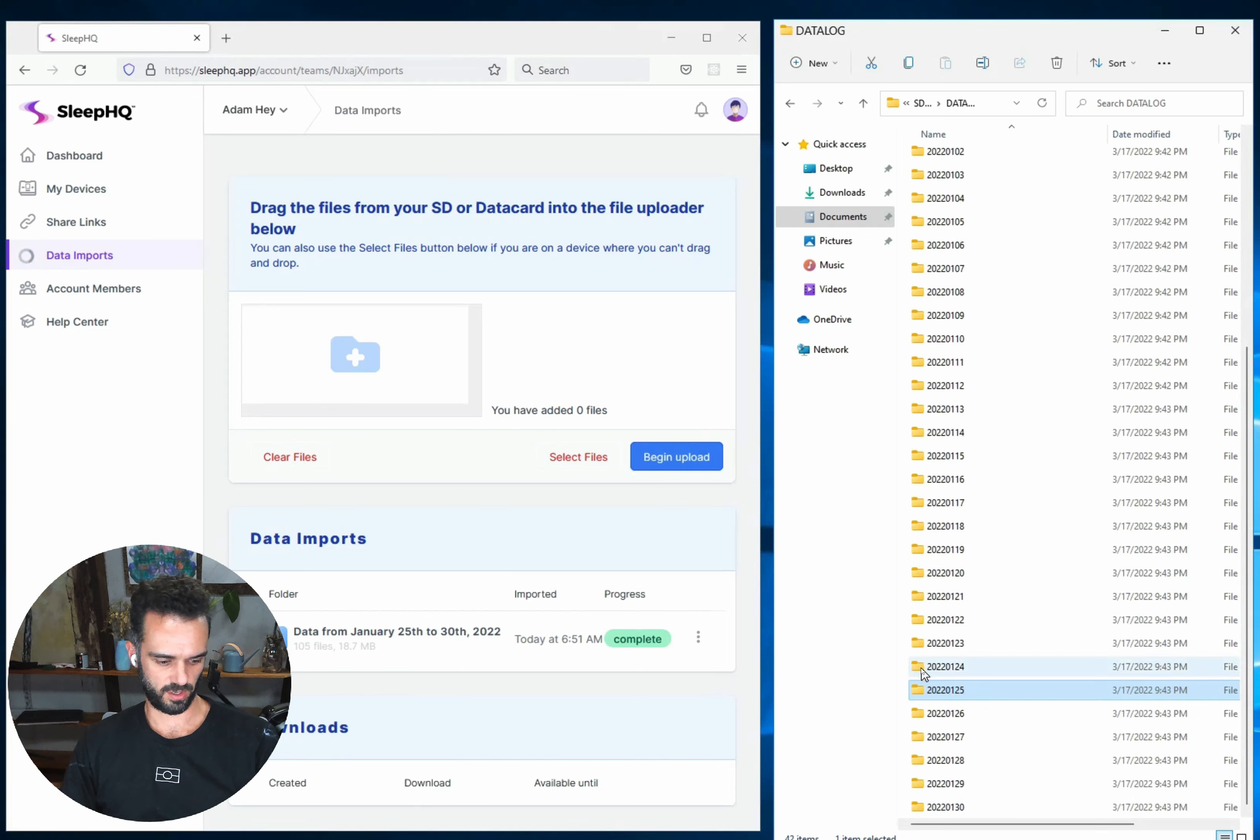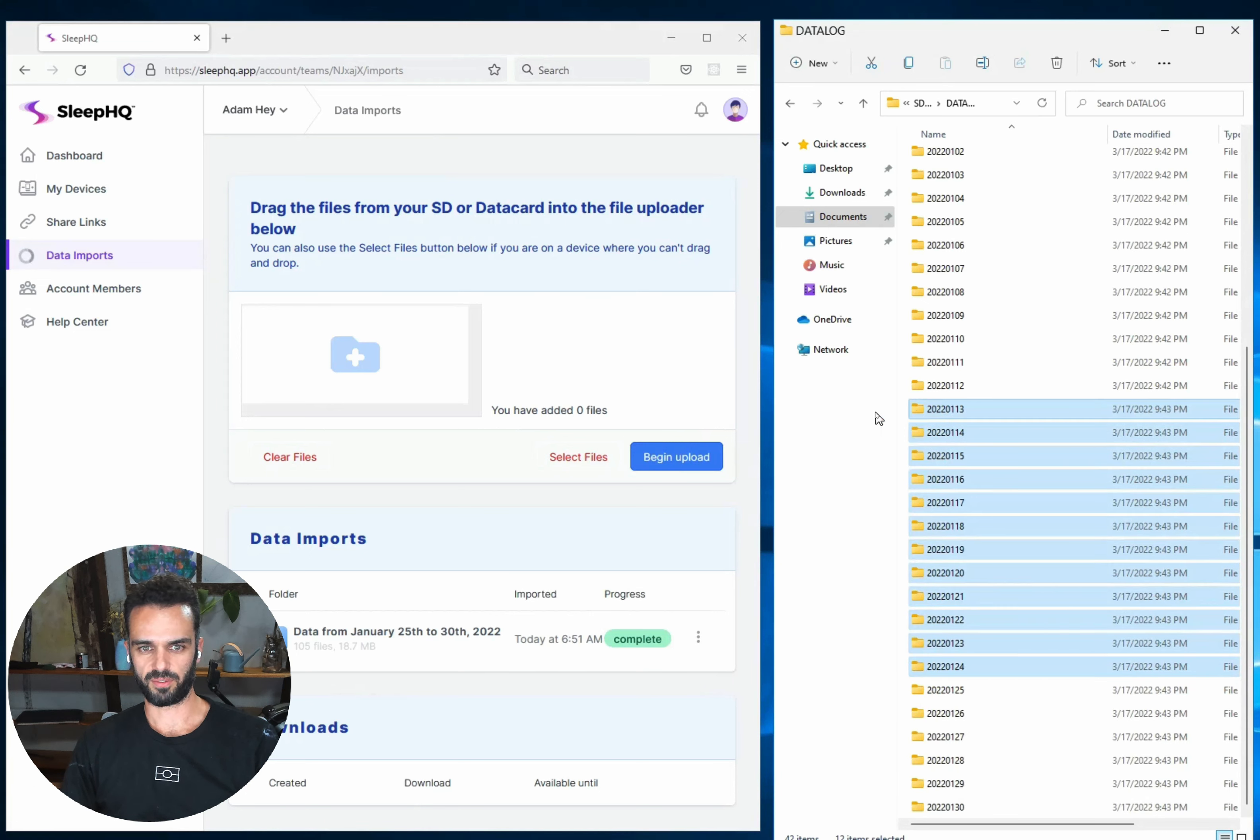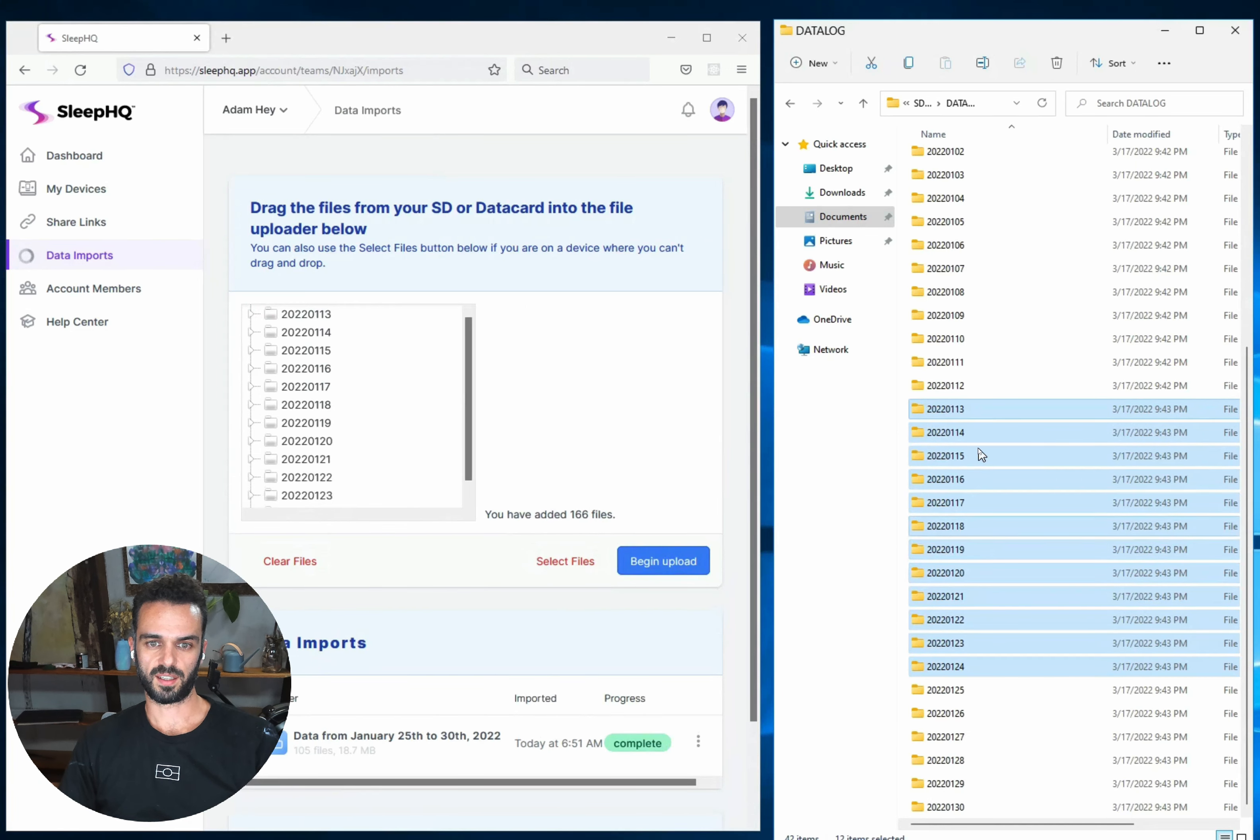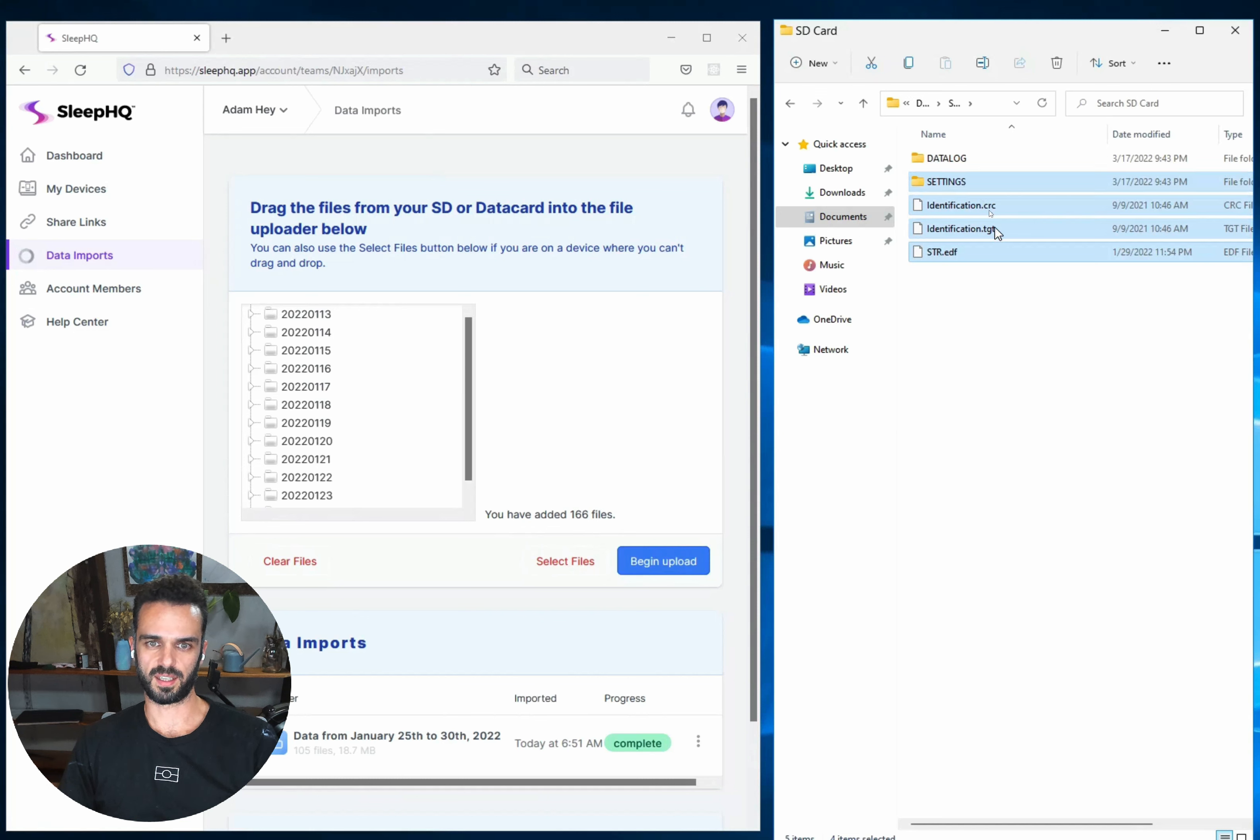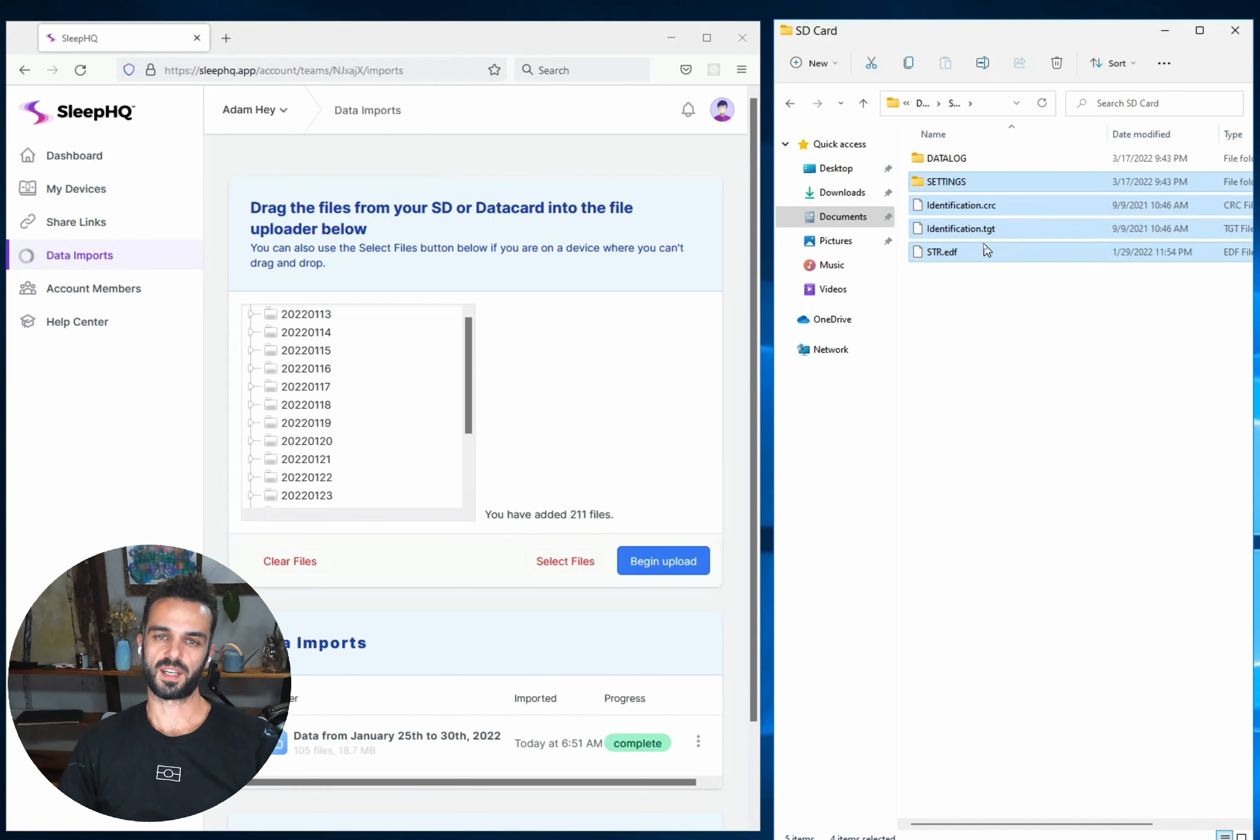So what I'm going to do now is I'm going to grab another chunk of data, the previous one like that, and we need a few more days this time, and I'm going to drag them in. Now, the important thing to remember here when you're dragging in these chunks out of your Datalog folder is that you always have to upload the settings and anything else that is in the top level of your SD card. So I need to drag them in every time.